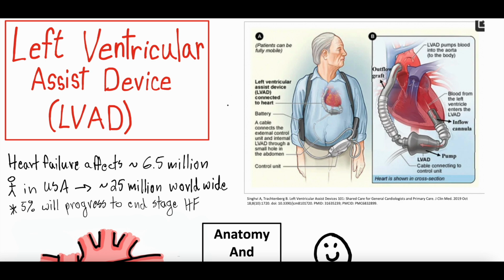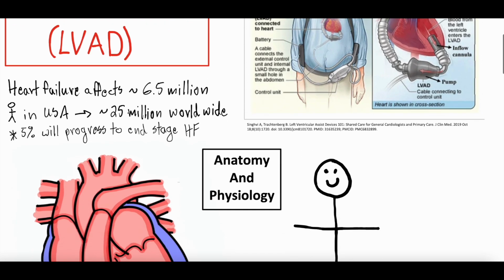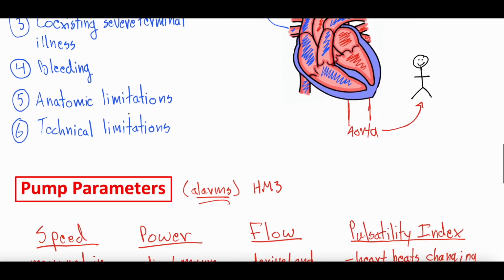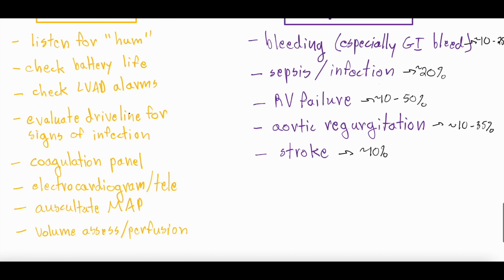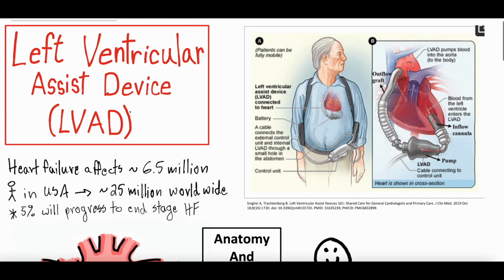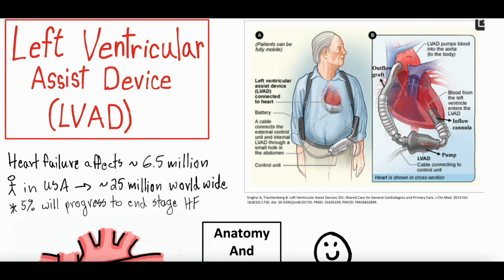Today we are going to dive into a really interesting topic, a topic that has really grown in the last 5 to 10 years, and that is left ventricular assist devices, also known as LVADs. In this video, we're going to dive into the basics of all things LVADs. We're going to talk about what they are, how they work, who they are best suited for. We're going to talk about the anatomy, the physiology, indications, contraindications, pump parameters, evaluation, complications. We'll go into some basics of alarms and all that kind of stuff. So whether you are a patient or a medical professional or trainee, you should hopefully find some good information in this video.